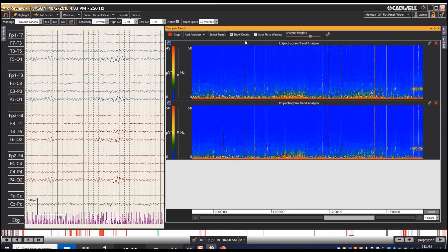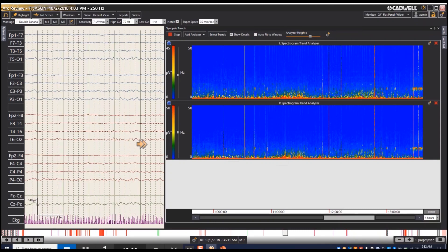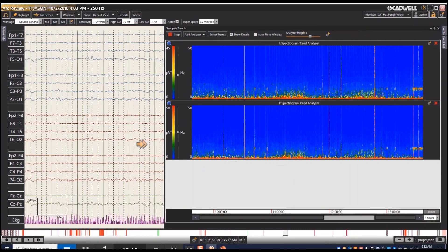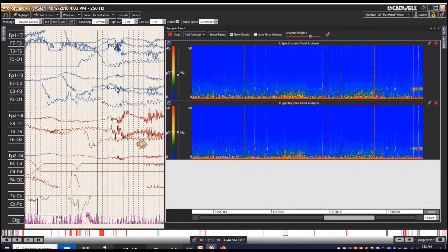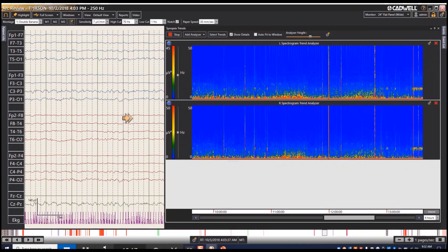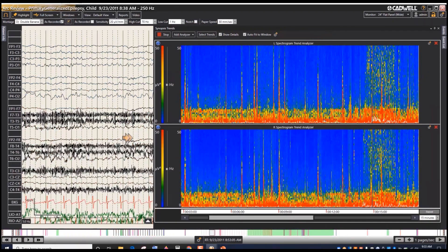There are some other frequency spectra here that are mostly artifact, suspected to be mostly related to arousals. As you'll see in the next example, you can identify the difference between arousals and seizure activity.